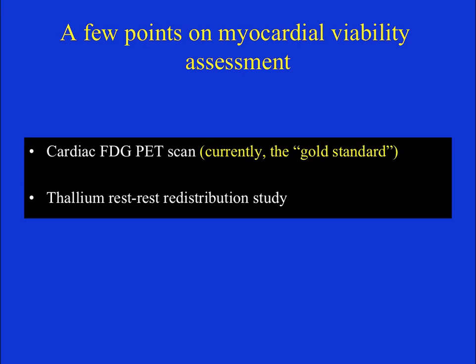However, the further steps of glycolysis cannot use FDG because the hydroxyl group in the second carbon position is important for the enzymatic actions. In FDG, the second position carbon has fluorine instead of a hydroxyl group, so the FDG is stuck there inside the myocardium, and we see uptake on the PET scan. That is how a cardiac FDG PET scan works.